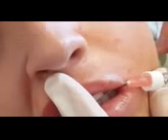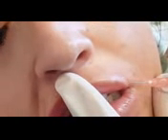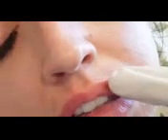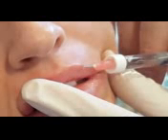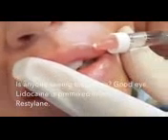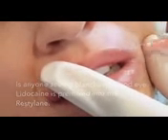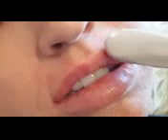I'm injecting now. Super light touch, and you can feel it, it's totally smooth. And then if you go like this, you can feel where the product stops, and it stops right there, so you go a little bit behind it with the needle. Super light injecting, so you see the product going in. And it defines the border.